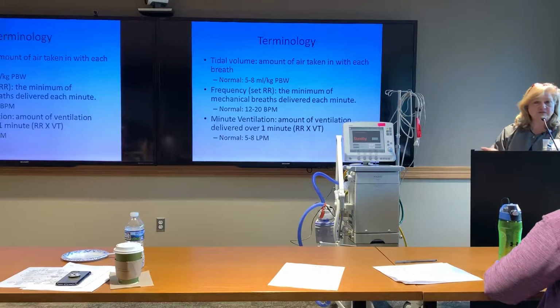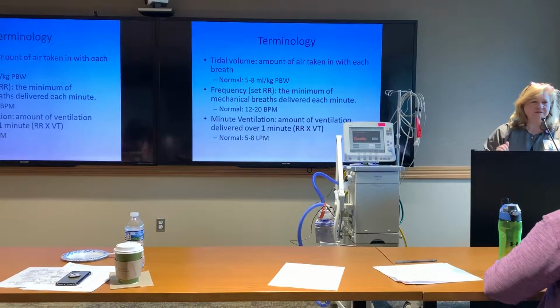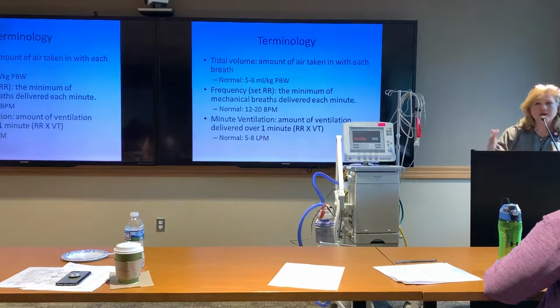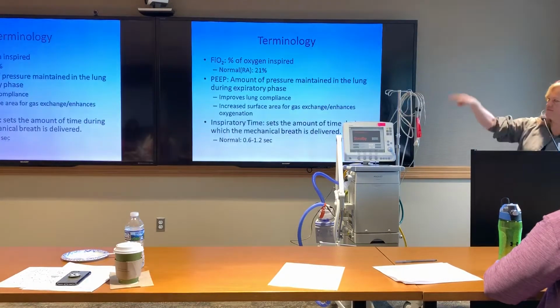Similarly, with FiO2, it's always important to know what that relationship is too. Just because we have a PO2 of 100 is great, right? But if it's taking 80% oxygen to get me a PO2 of 100, I got a whole lot of problems going on with gas exchange, right? So it's always something, normal isn't always good. You always got to look at that PF ratio as well. We'll get to that though. Sorry, I just went off.